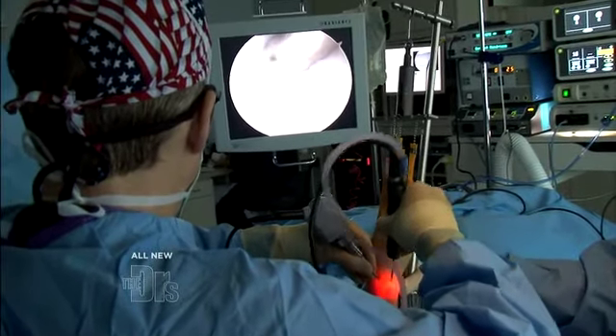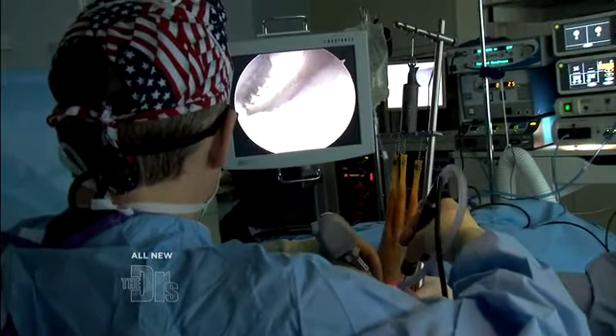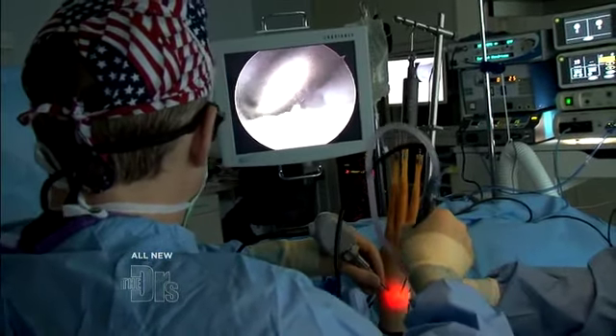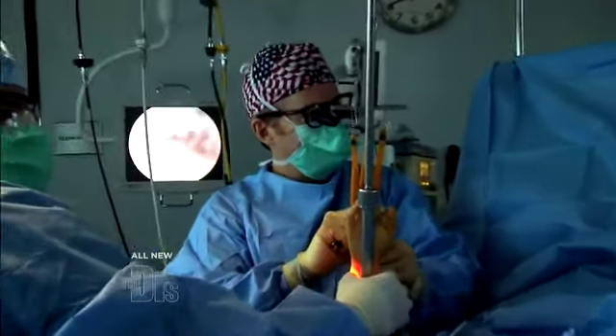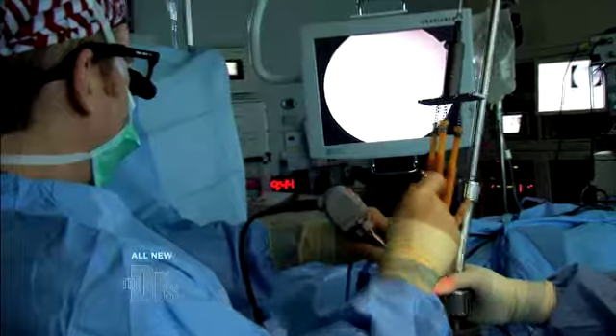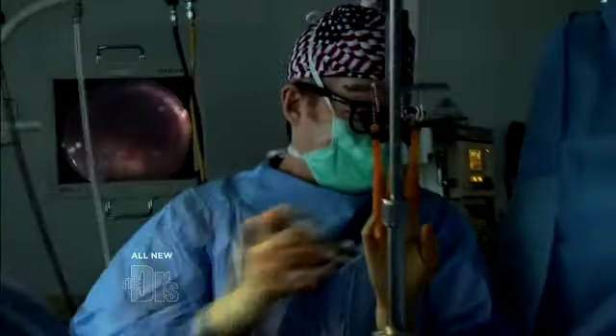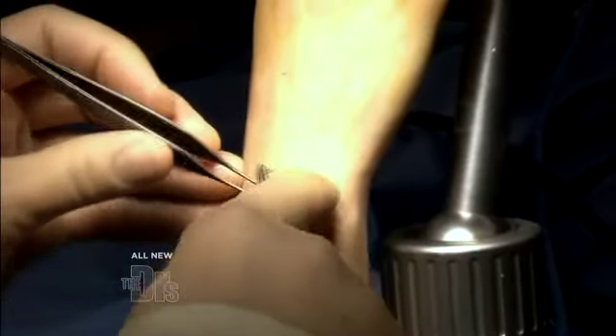I'm going to start trimming it out now. We just want to trim around the loose edges until we get back to a nice cartilage edge that's not flopping around. Now we're going to look over on the other edge of the wrist just to see if there's any other ligament damage. In this case our ligaments look fine and it's just a simple cartilage tear. I think we're done — I'm going to put a couple stitches and a little splint on.